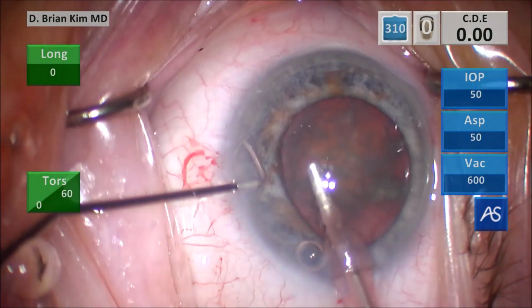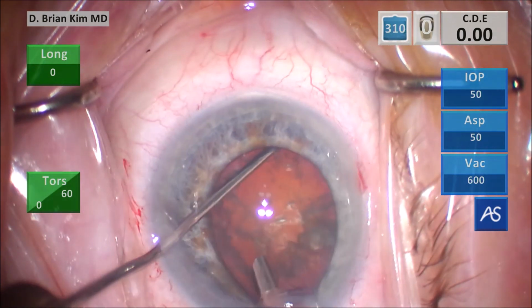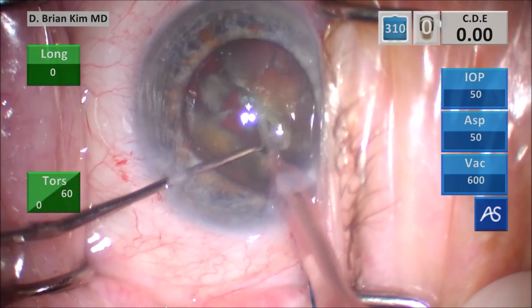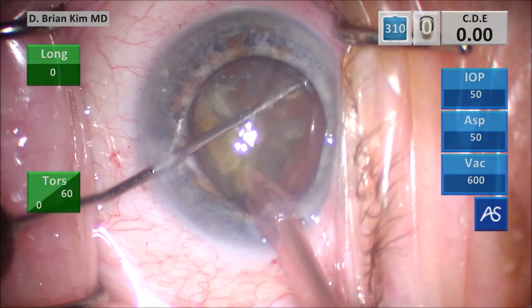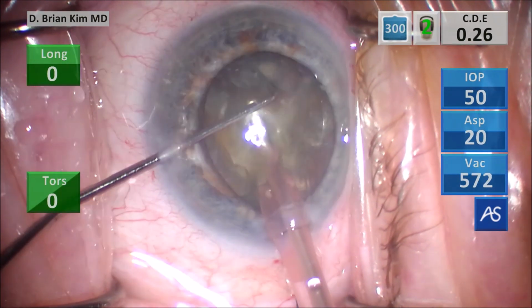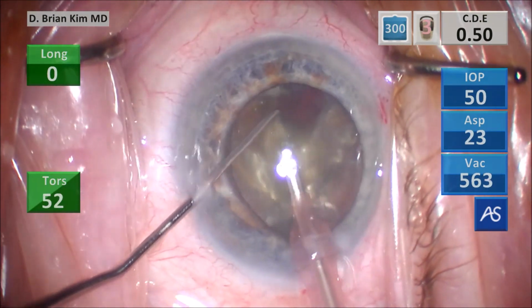I'm going to remove the surface epinuclear material here, place the chopper under the rhexis edge contra-incisionally, place the phaco tip vertically subincisionally. I'm able to get a nice grip of the lens, grabbing it and cutting it, bringing the instruments together, and then dividing the lens completely. You see I'm cracking and making sure both halves are separated. I place the chopper around the right heminucleus, pulling it centrally toward the phaco tip, and then fracturing the right heminucleus in half. Using some vacuum to hold that first quadrant, getting the chopper around it, trying to chop that lens into smaller bits, and then removing those smaller fragments.